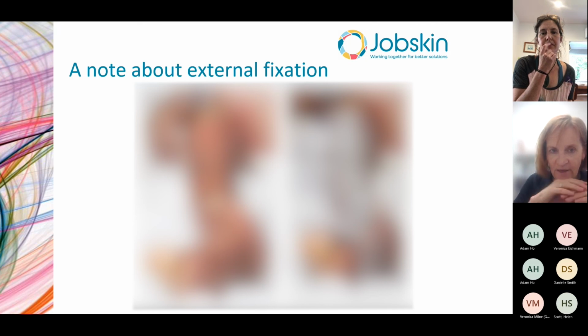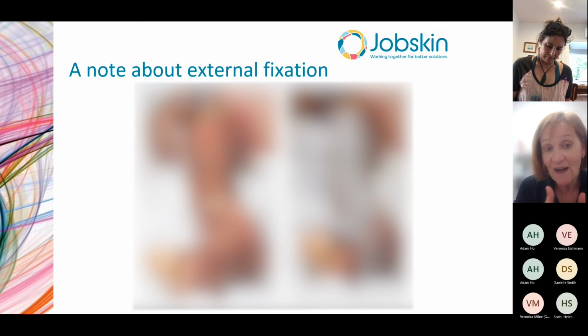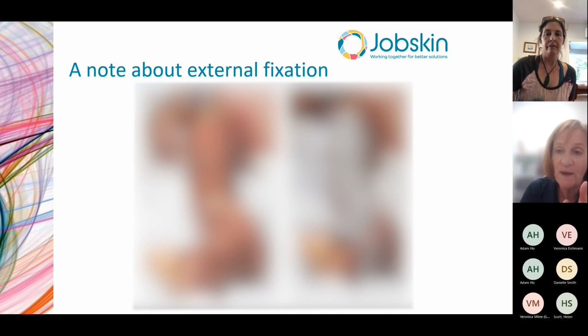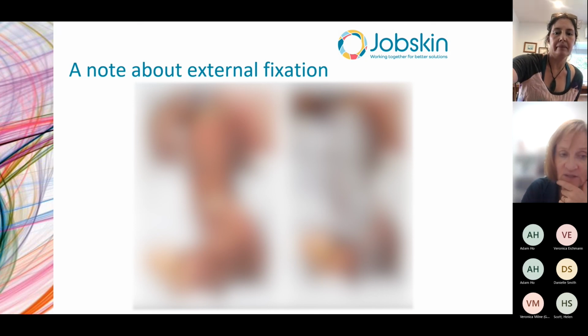If you tuck the spine of the tape under the external fixator and then you wrap around the limb, you can see, because there's marks all the way along the tape measure, obviously, we get the height that the pin site is by the spine there, and then we get how far it is away from the spine through all those little markings along the tape measure. So photographs, external fixator in place with the paper tapes in place are extremely useful.